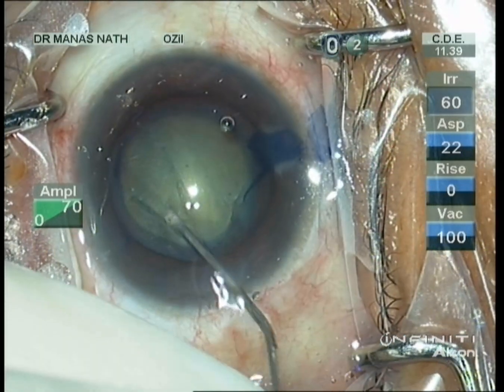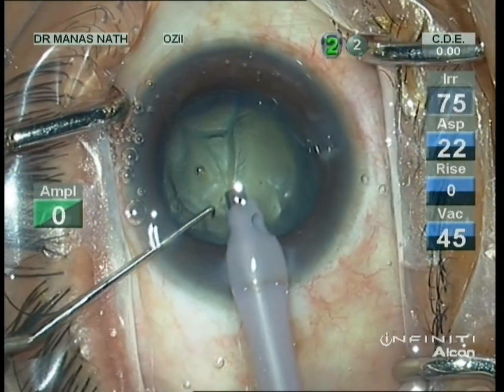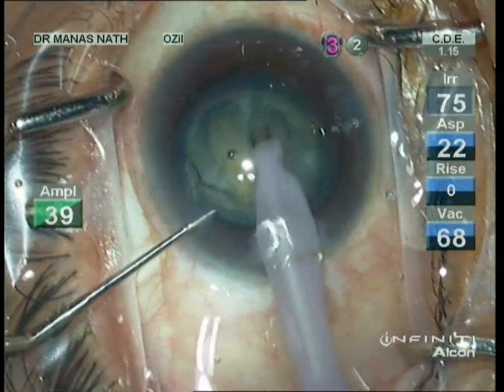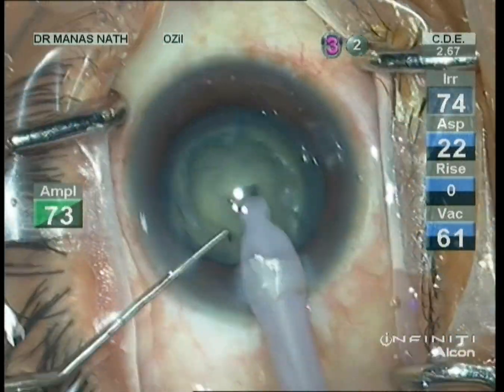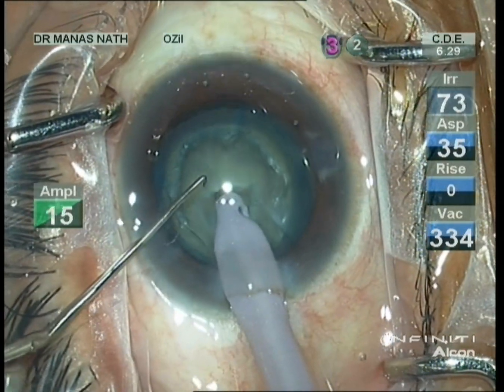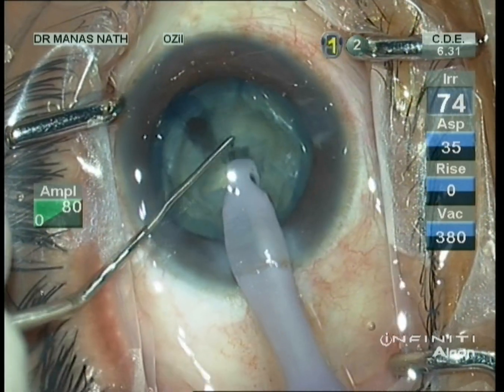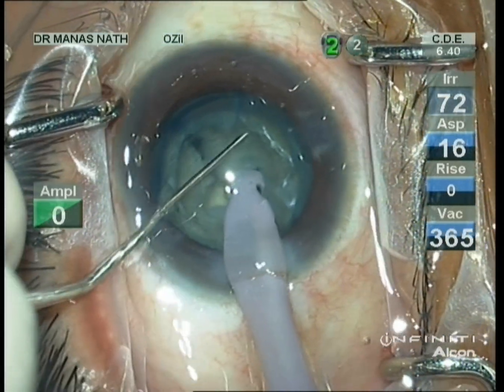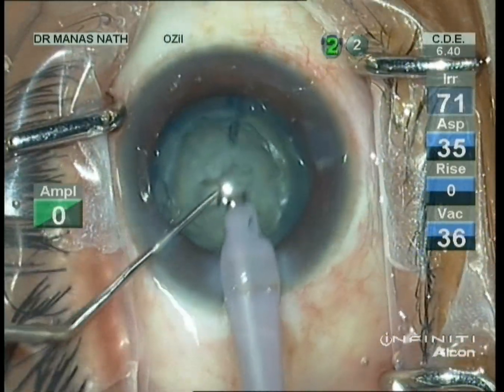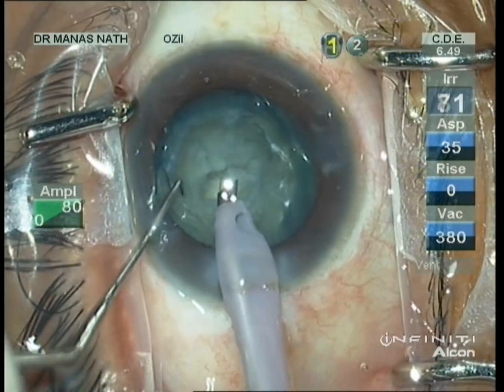I've achieved nucleus rotation, so now I am initiating phaco emulsification — emulsifying the superficial cortex so as to expose the endonucleus, making a short trench, advancing the tip deep inside, and initiating my chop.